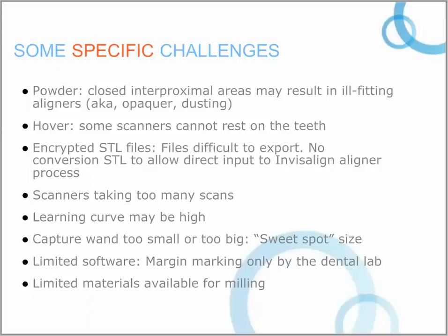But one of the problems, especially in the case of Invisalign, is that the powder tends to pool in the interproximal areas. And as it does, it may make for ill-fitting aligners. Align, as it looked around at the different types of companies that it wanted to partner with to be able to use digital scanning, thought this would be a problem for the folks that had dusting, opacifying, or powdering systems.